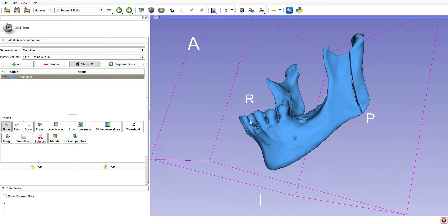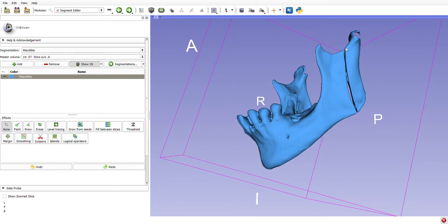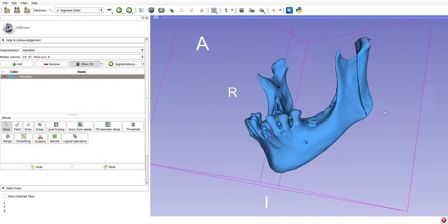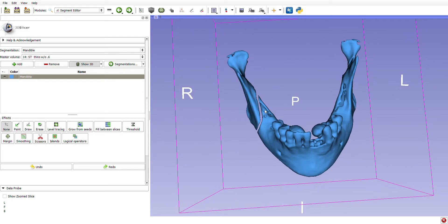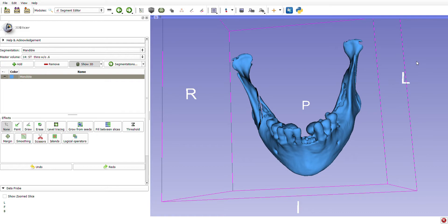In summary, here we have a vertical ramus osteotomy on the left and a sagittal split osteotomy on the right.